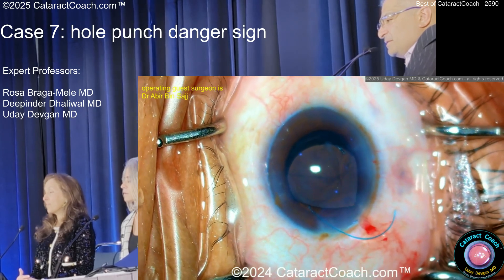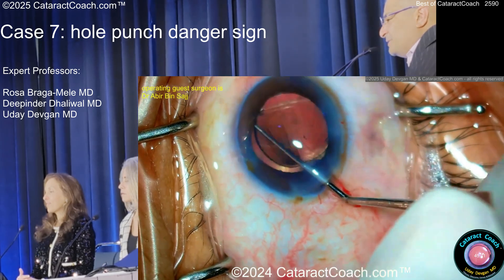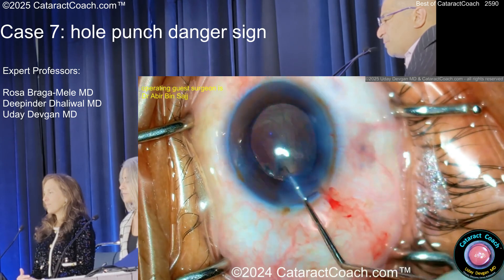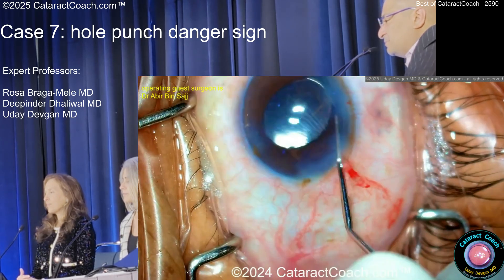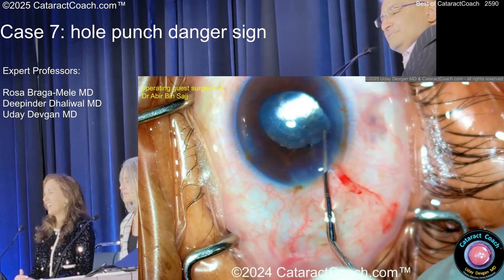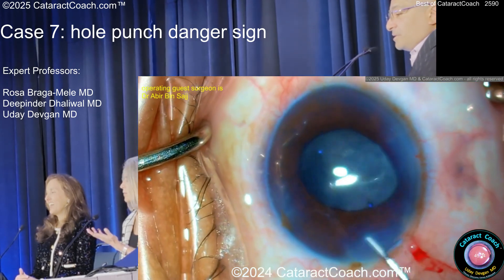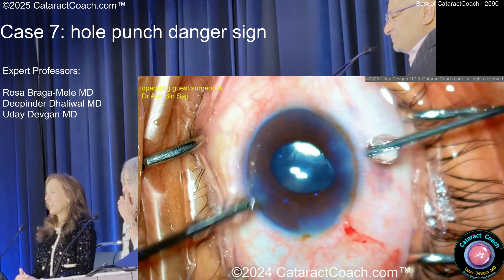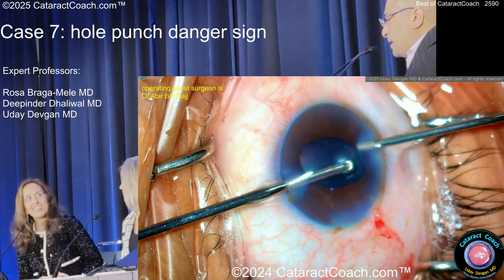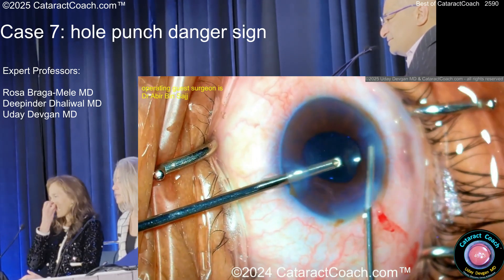Get a little more viscoelastic and get that thing lined up. In a case like this, I always like to put a suture. What do you tell the patient post-op? I always tell them they have bad tissue. I mean, there may have been some iatrogenic component, but the capsule was pretty bad. I don't know how they wouldn't have used triamcinolone before.